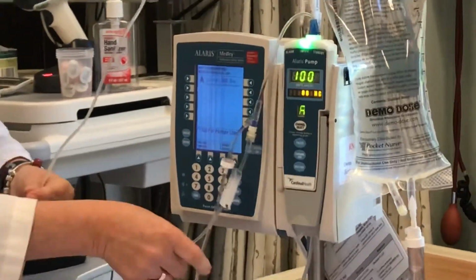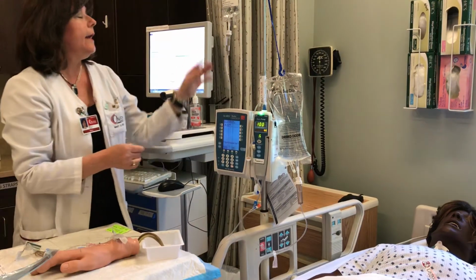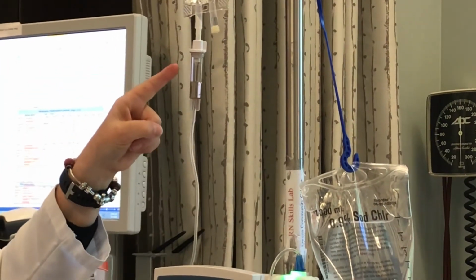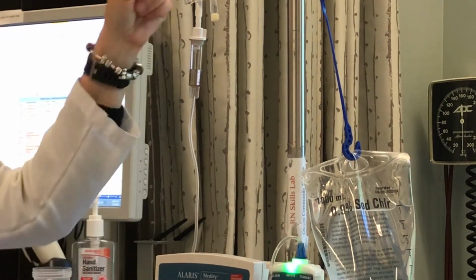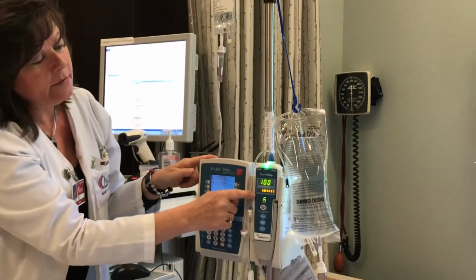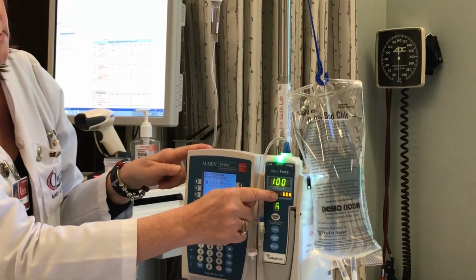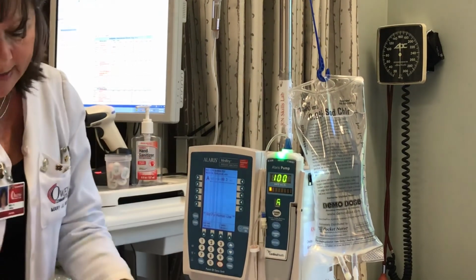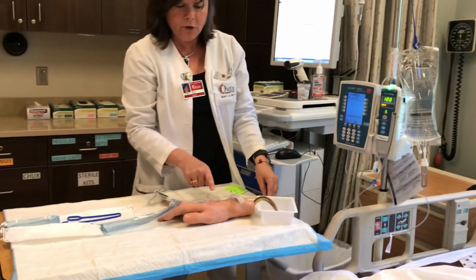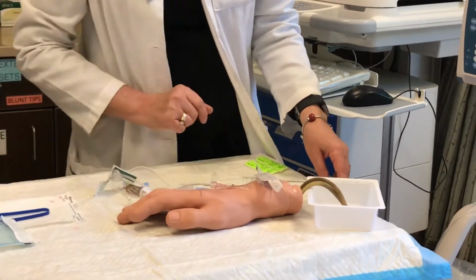I'm going to follow the secondary tubing and open that secondary clamp. And now I'm going to verify that my piggyback is infusing correctly. I'm noting that the drips are coming out of my secondary IV piggyback. The rate is 100 ml per hour. It's 80 milligrams secondary gentamicin. I'll then follow my tubing down to my patient, and I'm noting the site. There's no infiltration, and I do not observe any reaction by my patient.